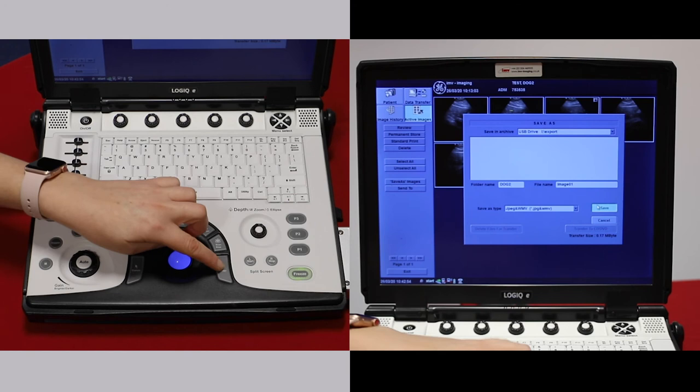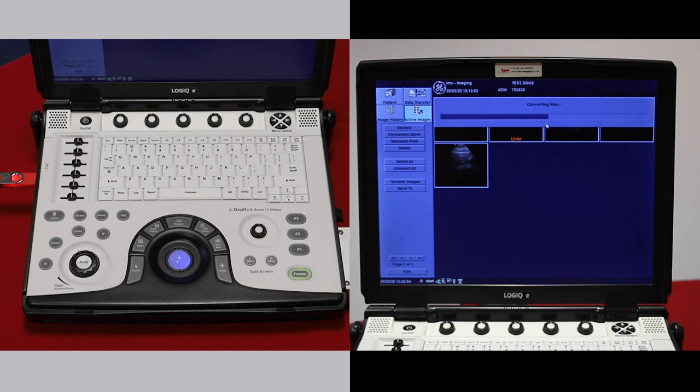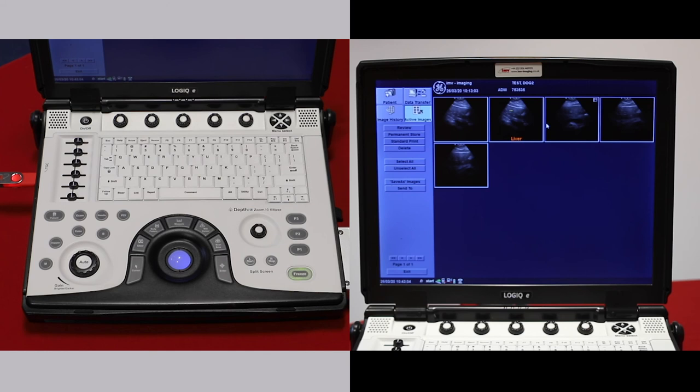Once the machine has converted the files and popped them onto your USB stick, that disappears. We're all done.